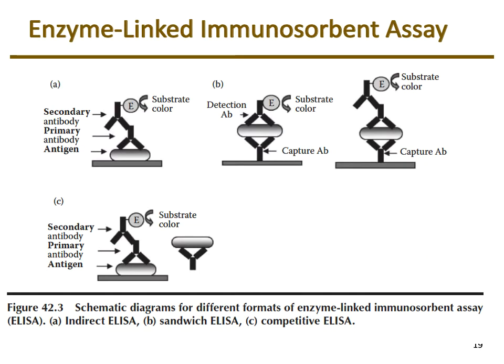So looking at a couple of the different immunological assays, with Enzyme-Linked Immunosorbent assay, you probably did this in a cell bio course, or we even do it sometimes in like an A&P course or an intro bio course. Or if you've taken immunology, this is a technique in which there's several different methods in doing this. So you can see down in the legend, we have an indirect method. So the antibody is recognizing the antigen, and then another antibody comes in and binds, and then you get a color change.